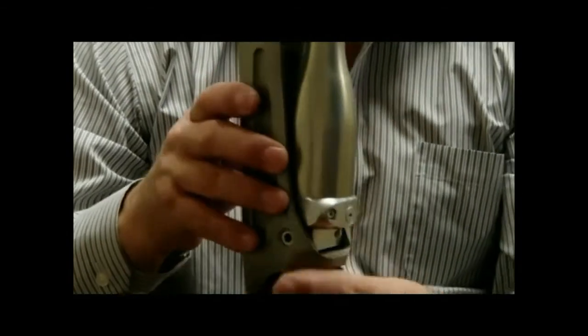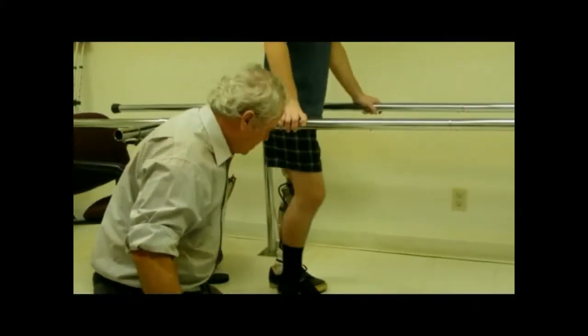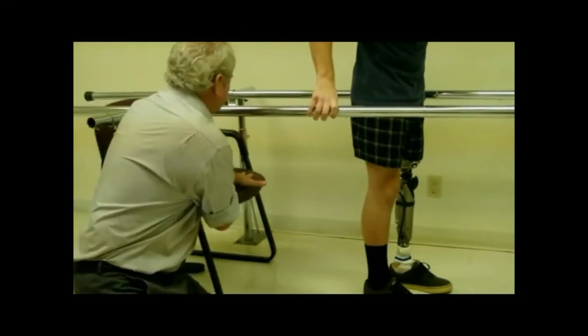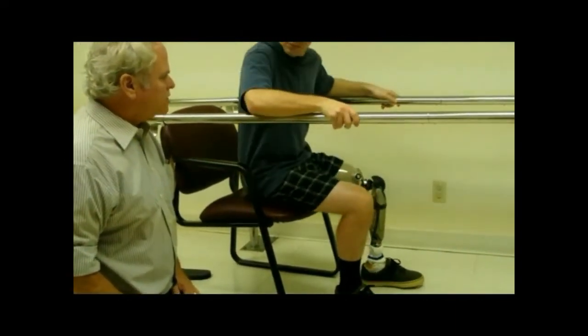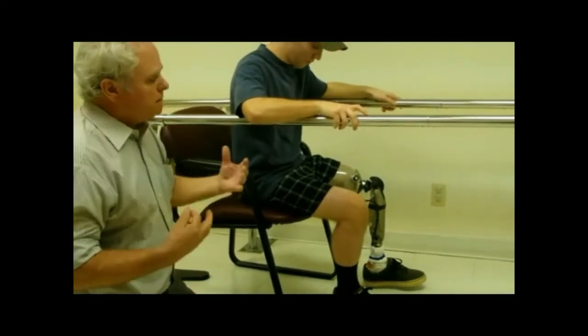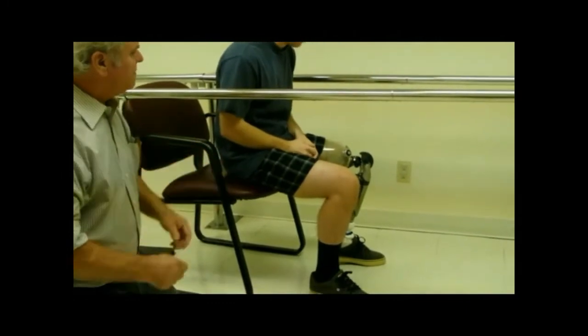Once you have that established and you have the correct TKA alignment set up with the knee, you are ready to walk the patient. Before I do, I'm going to have you sit one more time. Try that resistance. Okay, that looks more natural than what you had before. It's faster, okay, but this is more appropriate for your weight.